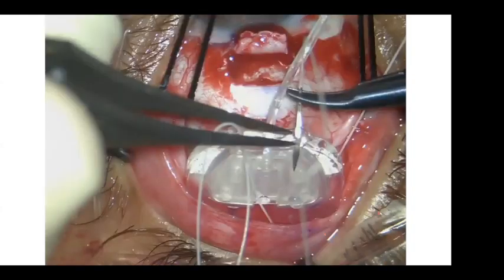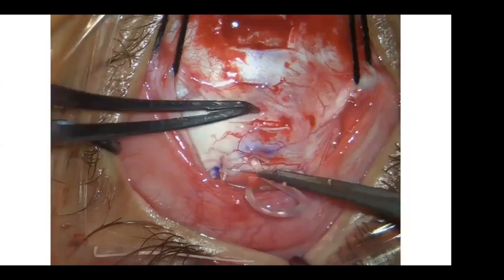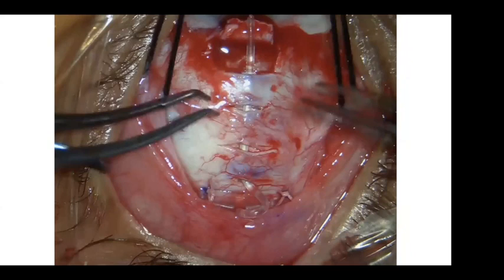And then here are the pre-placed sutures I place, so that I put the sutures on the implant while I see everything, before I'm working posterior. Definitely that was not my technique earlier. I used to put the implant and suture, and then after I fix the implant posteriorly, I hold the tube and go through the tunnel, from one tunnel to the second to the third tunnel. So we have 3 tunnels.